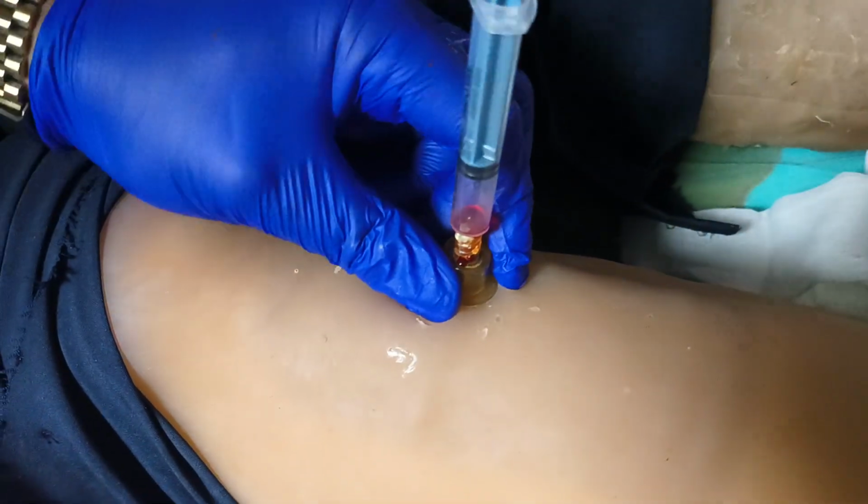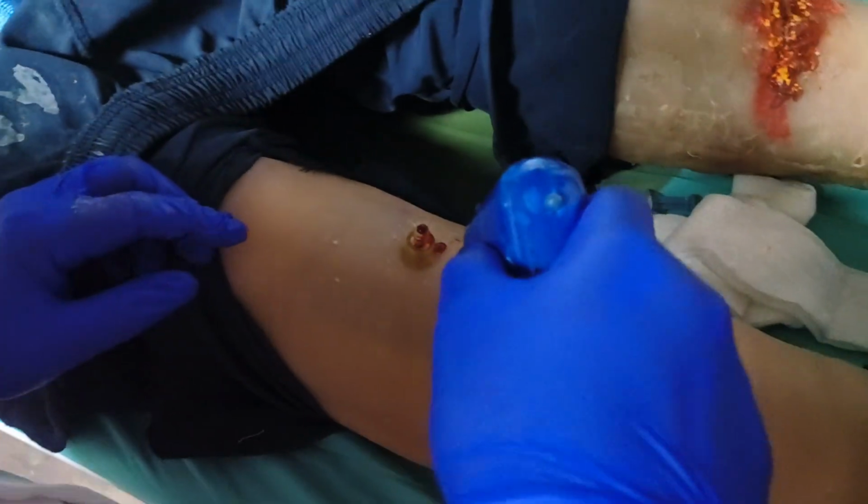The yellow needle was probably not appropriate length, so we will try with the blue needle again just to show.